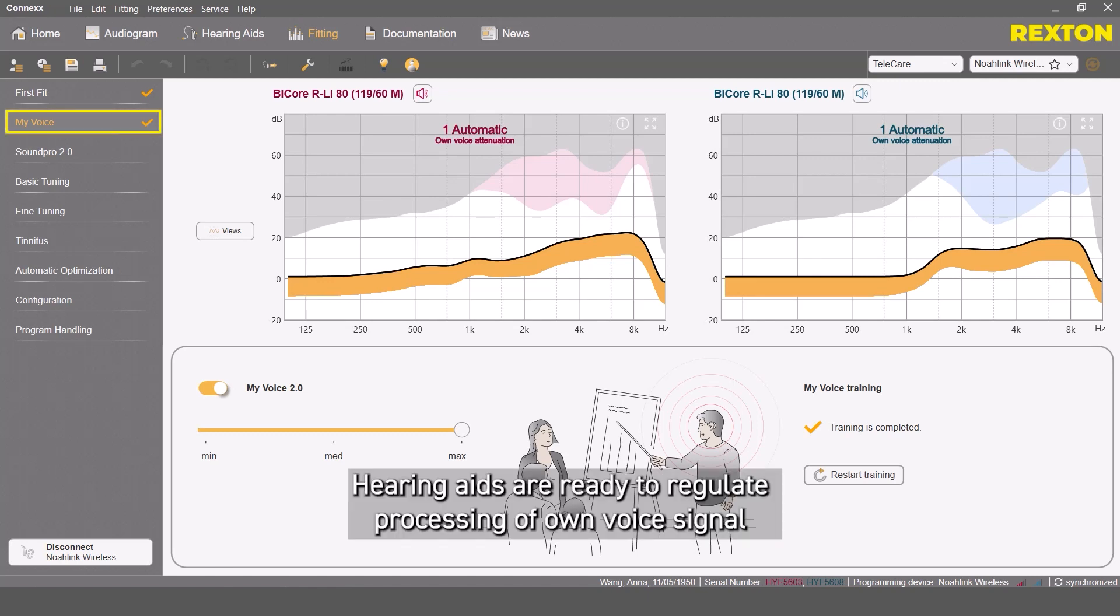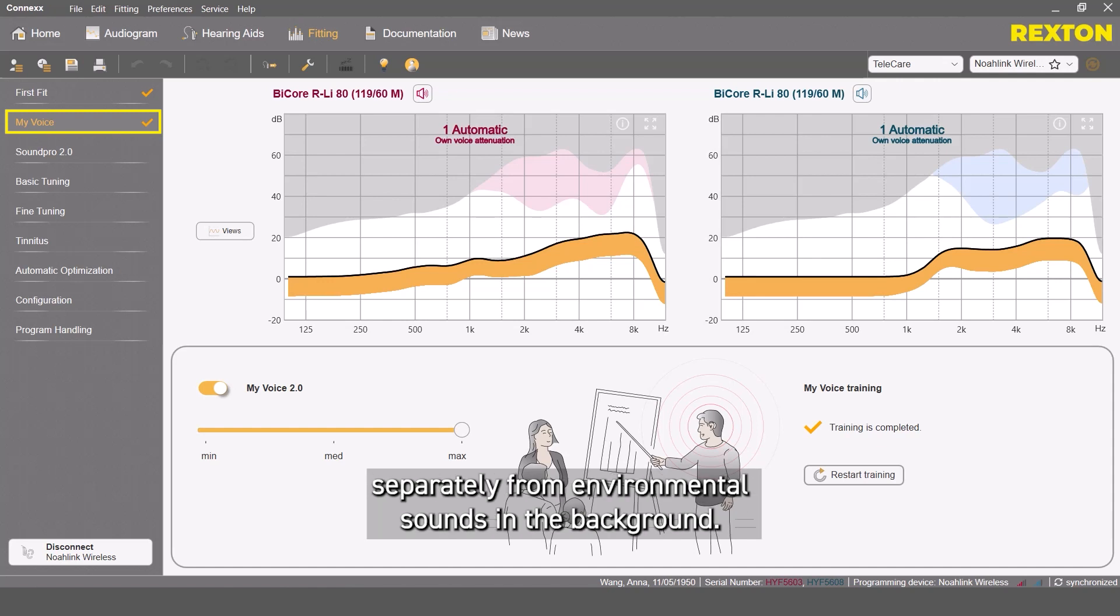Hearing aids are ready to regulate processing of own voice signals separately from environmental sound in the background.